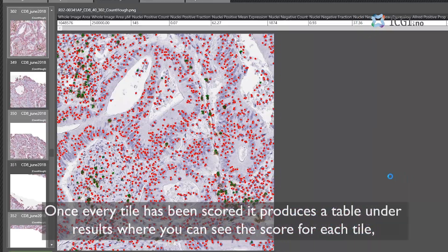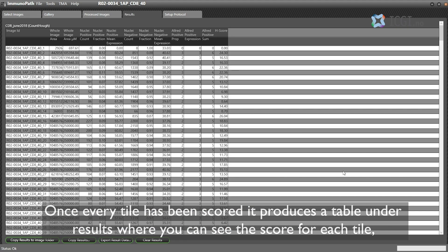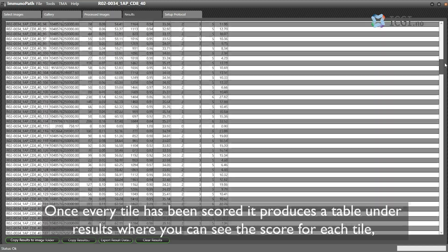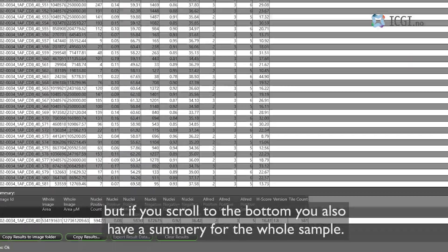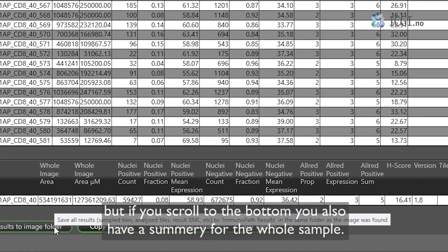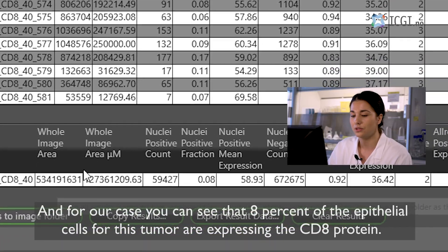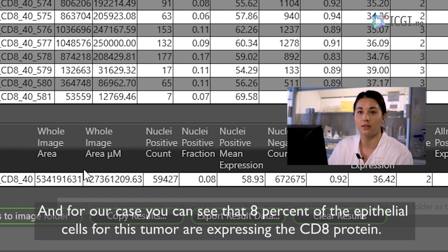Once every tile has been scored it produces a table under results where you can see the score for each tile. But if you scroll to the bottom you also have a summary for the whole sample. And for our case you can see that 8% of the epithelial cells for this tumor are expressing the CD8 protein.